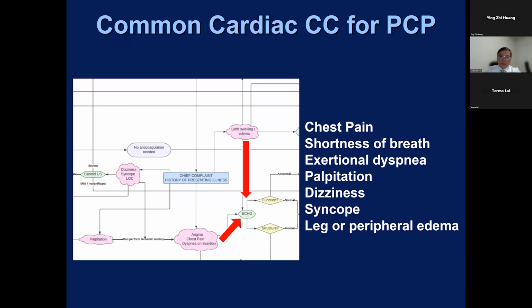So this is important: how we cardiologists take it from there after you refer a patient to our office, and what we can do to evaluate this patient. If you look at this diagram that I have here, most symptoms will lead to an echocardiogram. Most patients came with an EKG done by their primary care physician already.